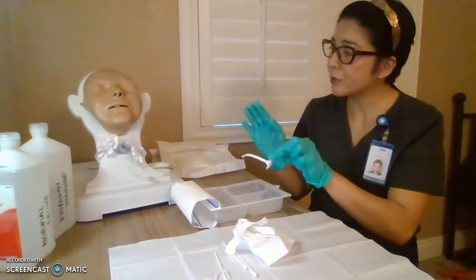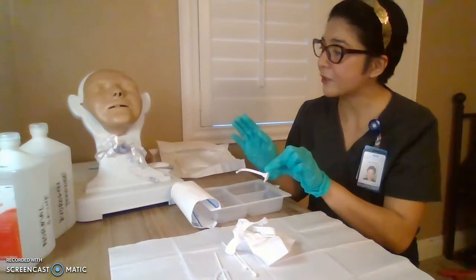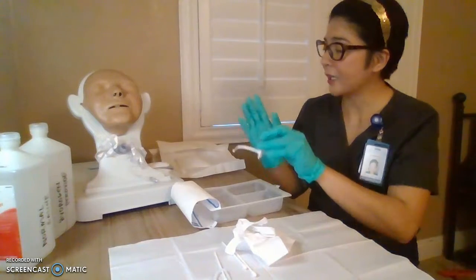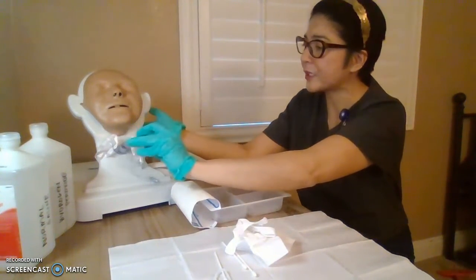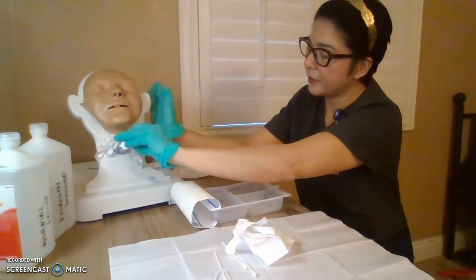So right now we are going to reinsert your inner cannula, Mr. Smith, so let me know again if you feel that you need me to stop. Just raise your hand, okay? So check on his vitals, check on your patient. We are now reinserting the cannula. Okay.